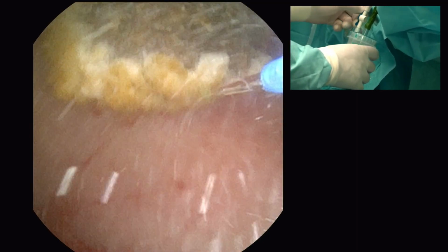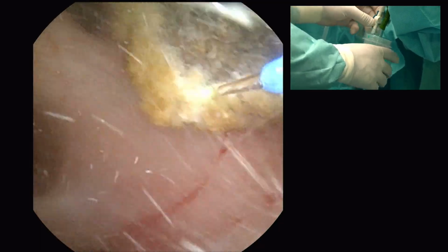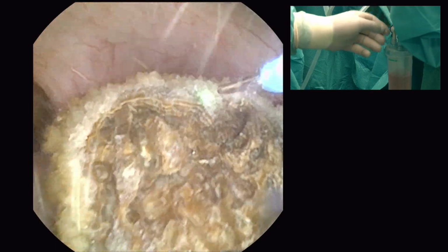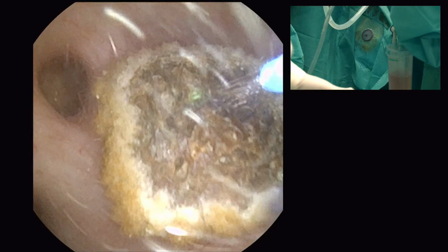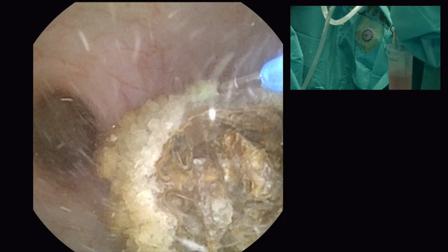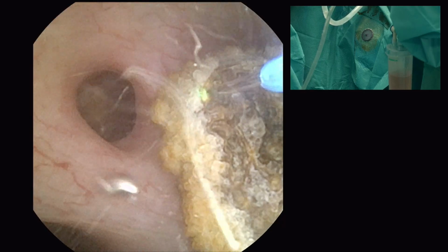There is more movement. Sir, are we audible to you there? Imran sir is asking some questions, sir. Yes, I am audible. So what is the source of irrigation? You can see there are a lot of respiratory movements going on, and it's not helping me, because I could touch the mucosa. So I have to be very careful.